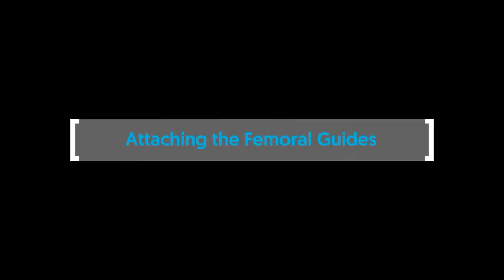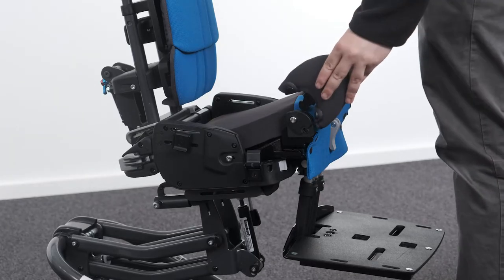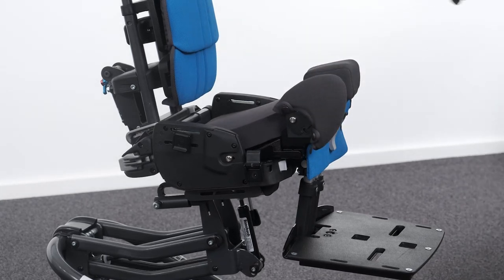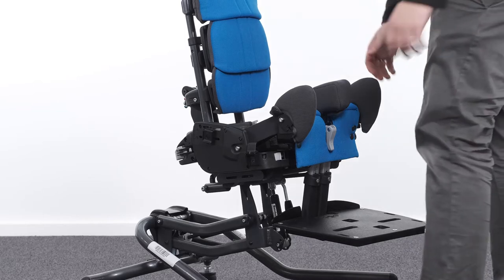Attaching the femoral guides. To attach the femoral guide, slot the femoral guide stem into the receiver on the seat and press downwards. Check that the femoral guide has self-locked by pulling upwards on the femoral guide.